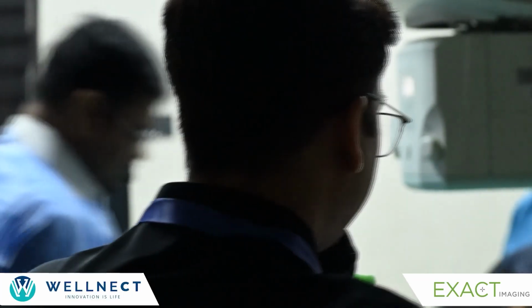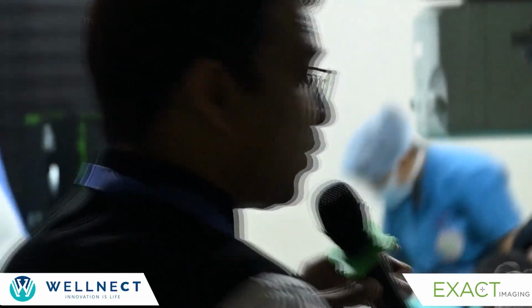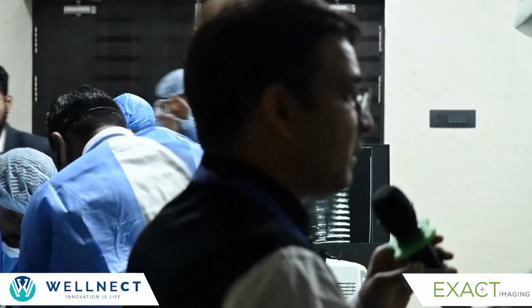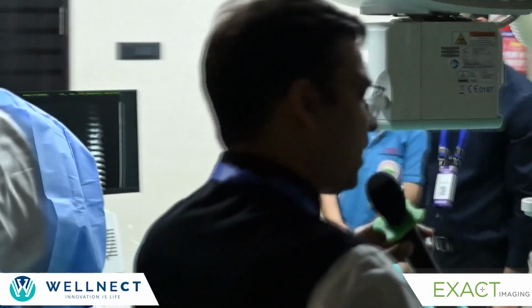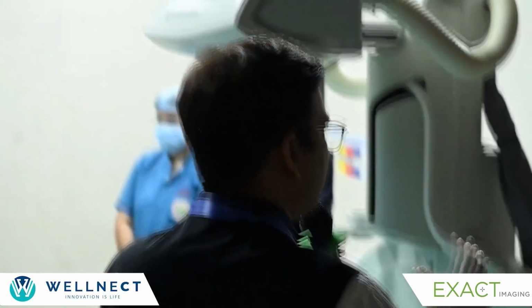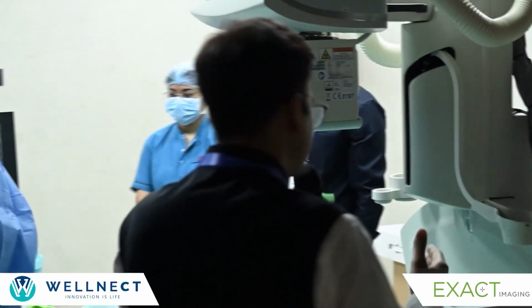Now it is good. Now the probe which Dr. Abhijit is using is a 29 megahertz probe, which is a transrectal probe. It is a side-firing probe, as compared to the other ultrasounds which ideally have 9 or 10 megahertz. So let us see how this increased frequency will make a difference in imaging of a prostate section.